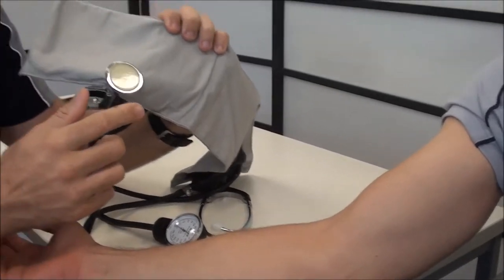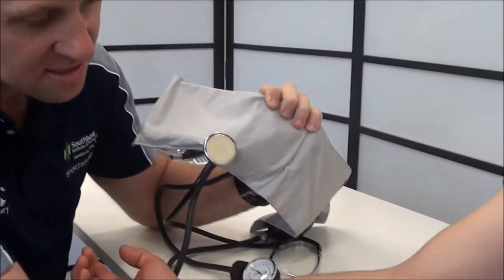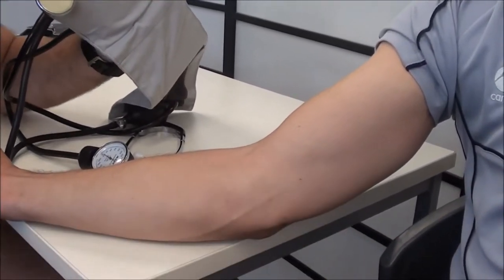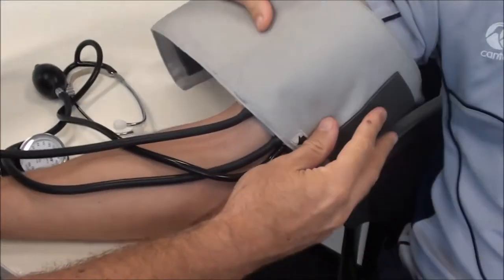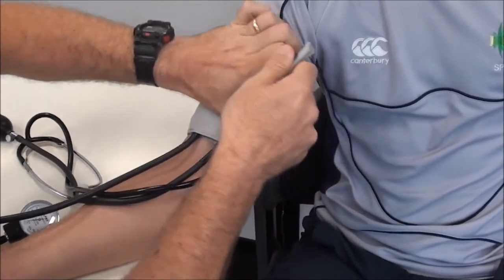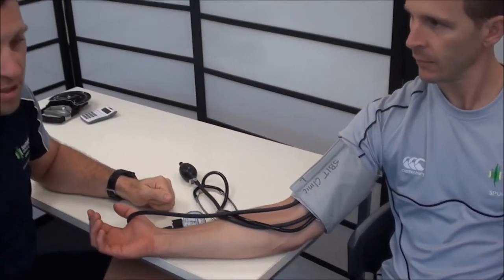This cuff has a stethoscope built in, and I'm going to place the stethoscope over the brachial artery, which is found just on the inside of the bicep. I place the stethoscope in position, wrap the cuff around so it's nice and snug, and that's all set up ready to take the blood pressure.